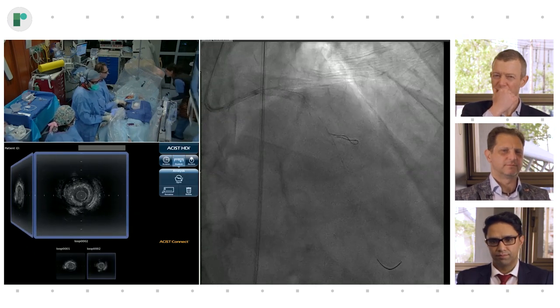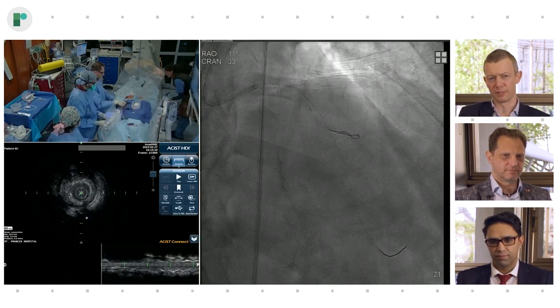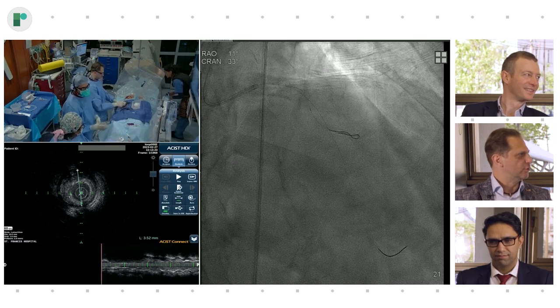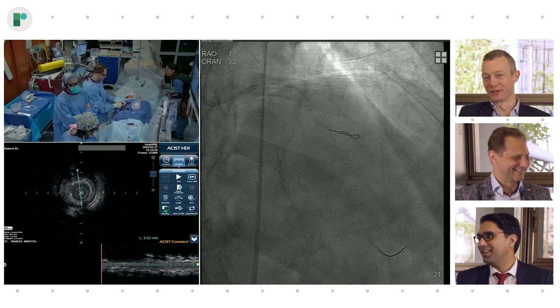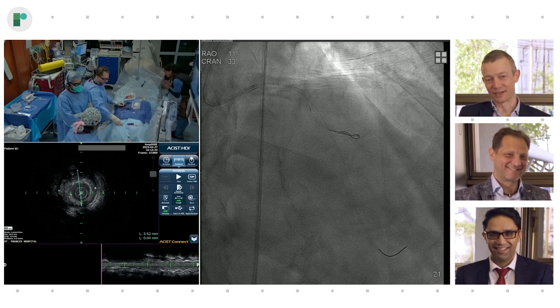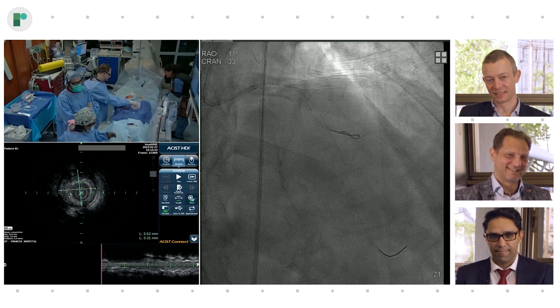So this was 10 millimeter per second, so that's 8 frames per millimeter, 6 to 8. Don't recall, 6 or 8. We'll leave the math to the Dutch guy. No, but it's not so relevant. But just to say it, it's quite fast. And here you start measuring, right?